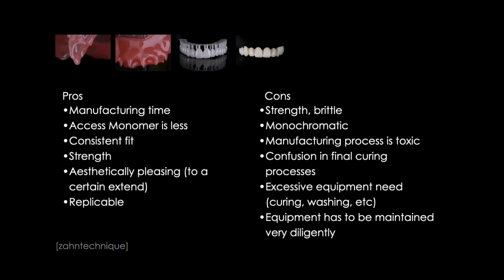The manufacturing process is toxic, right? Non-cured resins are not healthy, so certain people should not deal with them. If you have a pregnant assistant or pregnant lab tech, that person should not deal with non-cured resins, for example, or even be close to them. In our laboratory, we have a suction over the whole area where we work with non-cured resin, where we mix them and shake them, so that we don't have the toxic fumes going into the laboratory.